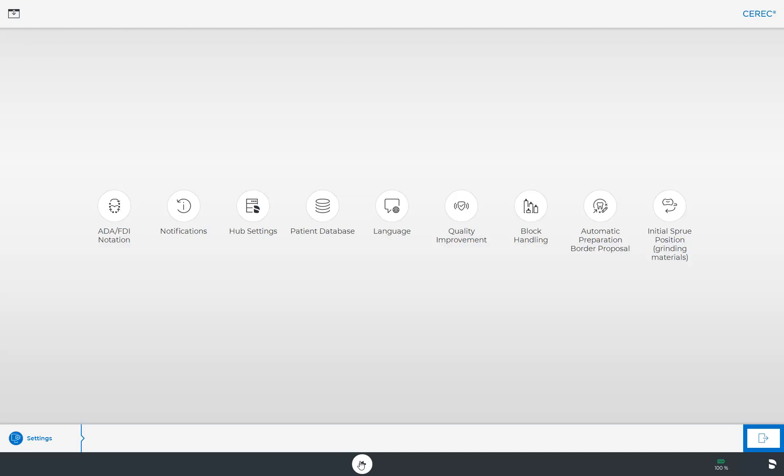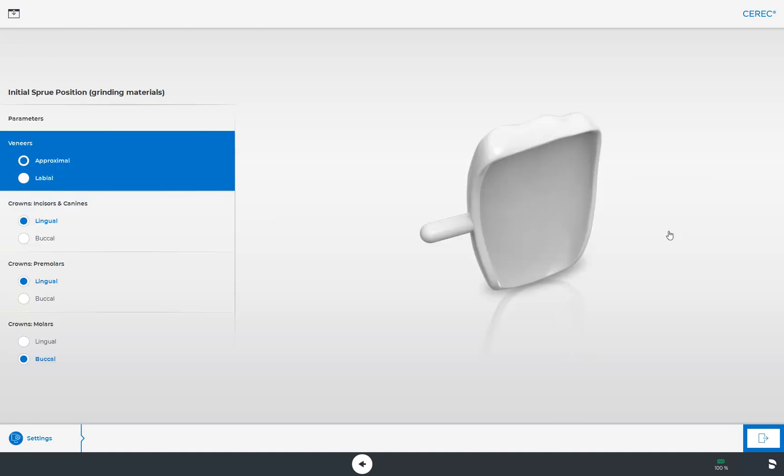We will also take a more detailed look at the last submenu, Initial Sprue Position. The advantage in setting these parameters is that the position of the sprue location for the different tooth and restoration types can be initially preset. You can decide, for example, whether the sprue position for a crown should be set on the lingual or buccal surface.